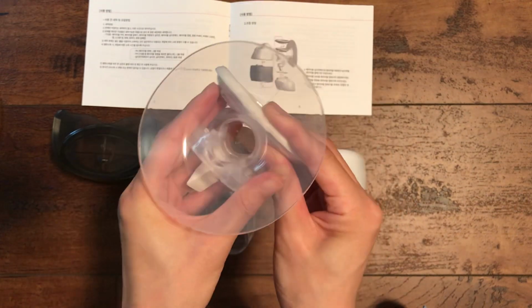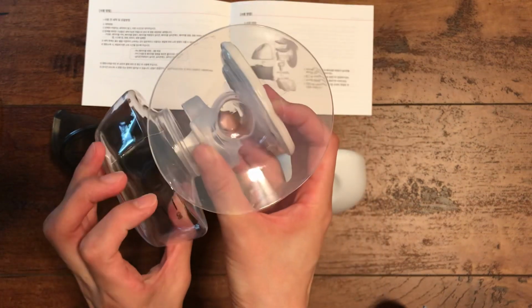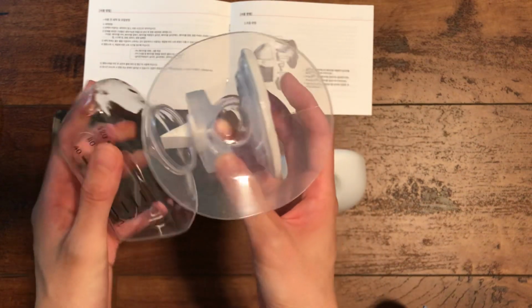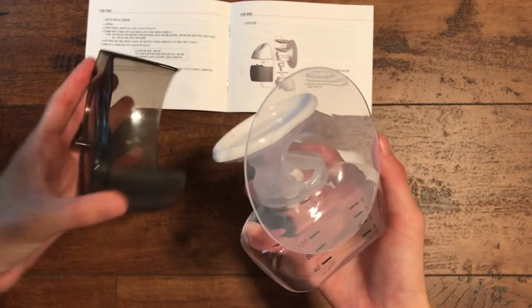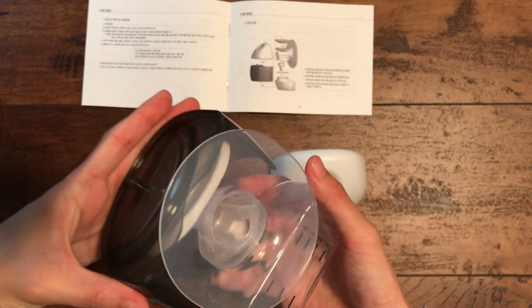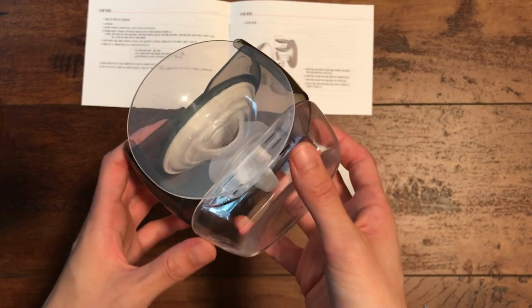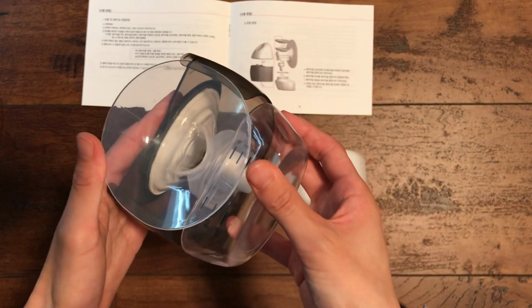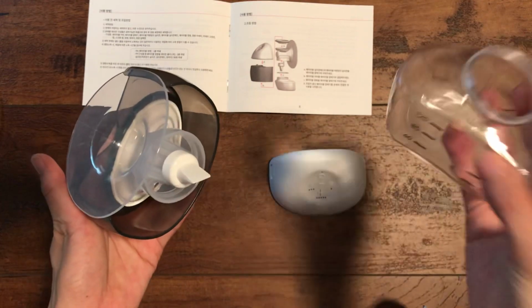Alright, so I think the mistake that I made in the last video was I went ahead and put in the bottle. But if you do this, then you can't quite secure this brown unit to the phalange, so I don't recommend doing it. What I mean by that is, you can push it in, but it's not going to be as flush as if you're doing it without the bottle.